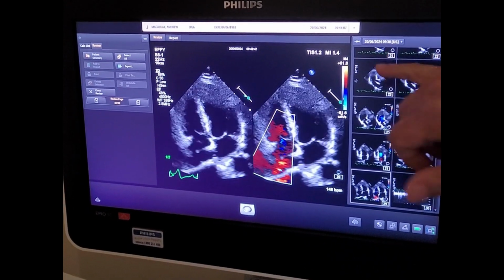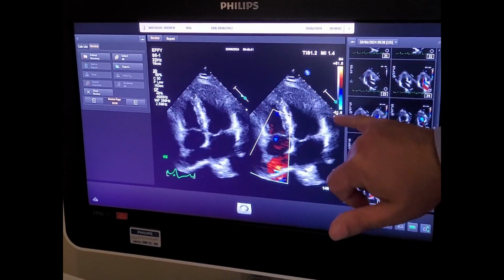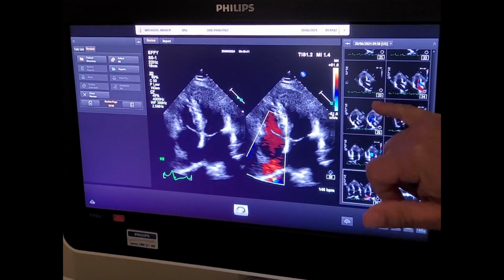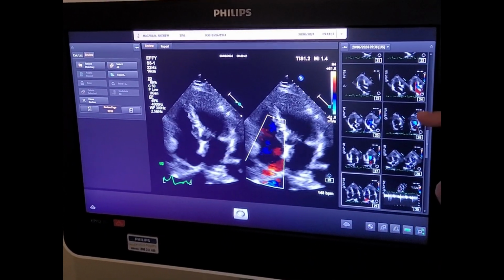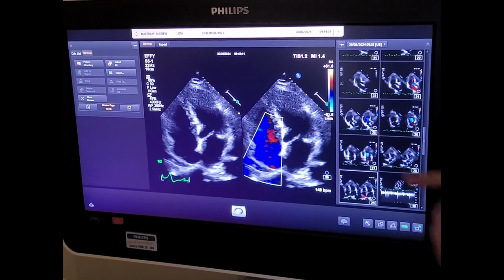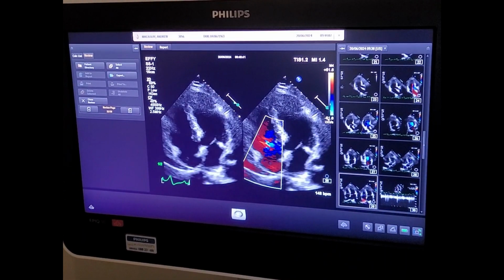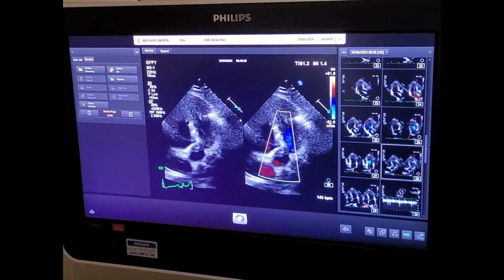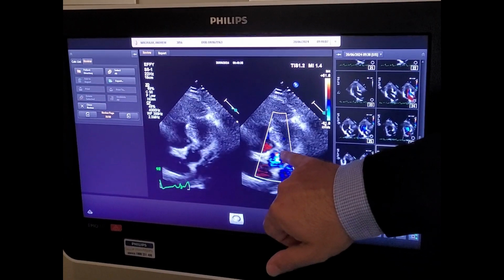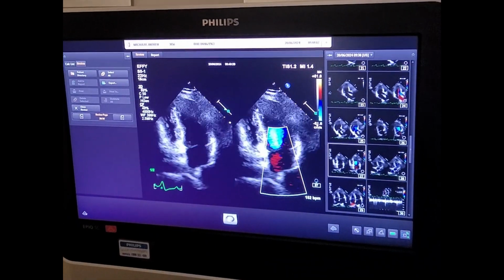This is really cool. So, colour flow is indicated on Doppler. It's the blue down, red up. It's quite different to the Doppler shift you get in physics and astronomy. But it's effective. It's just looking for abnormal flow. It's a screen for abnormal flow, and essentially we're not seeing too much abnormality. A few little cells just flicking back through there, but not very much.